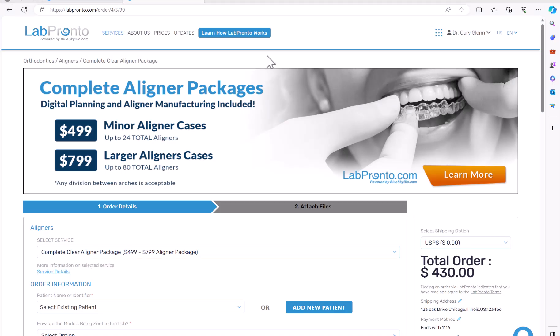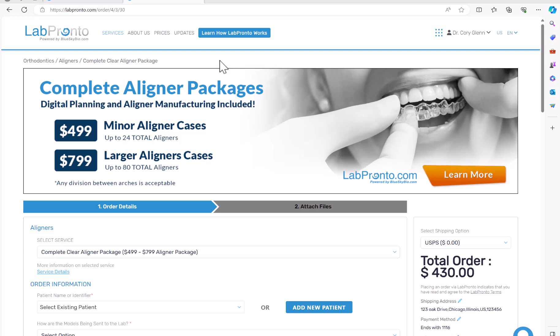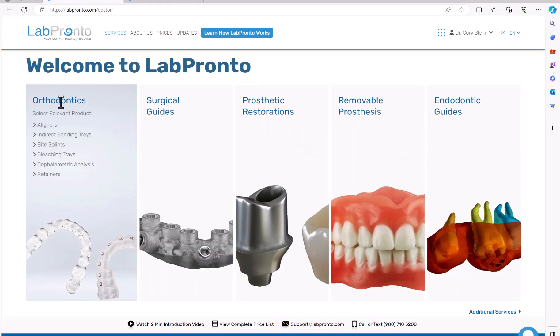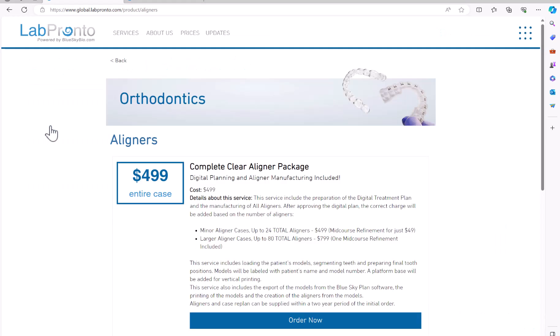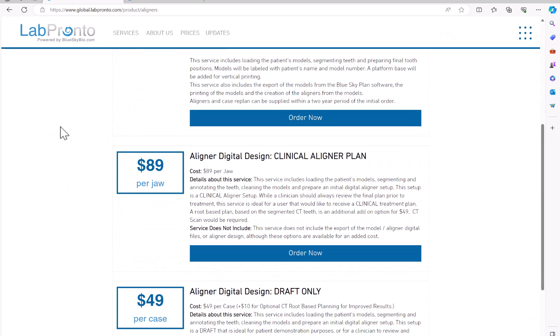If you would like assistance with your aligner cases — either for the digital tooth setup or the complete aligner package, both taking advantage of true anatomical tooth movement — you can place orders via labpronto.com. Aligners can be manufactured at fantastic pricing, or you can order just the digital tooth setup by going to labpronto.com, choosing Orthodontics > Aligners, and selecting the relevant package.